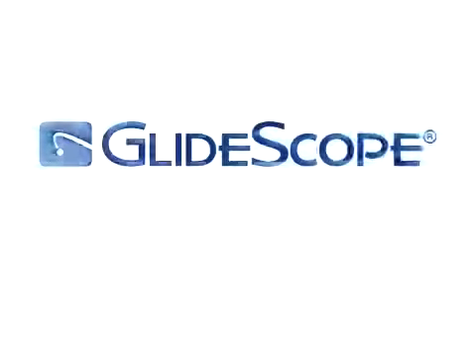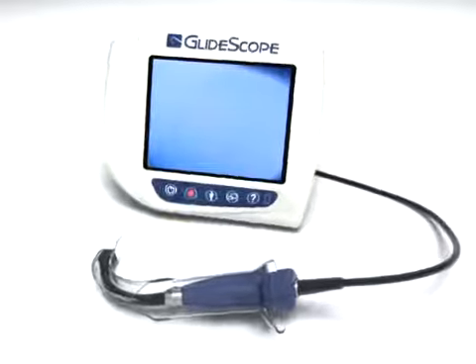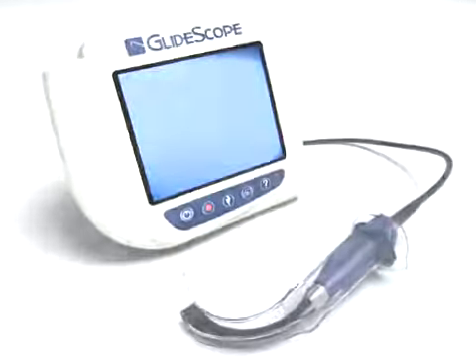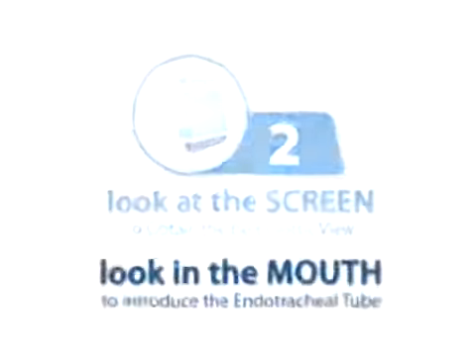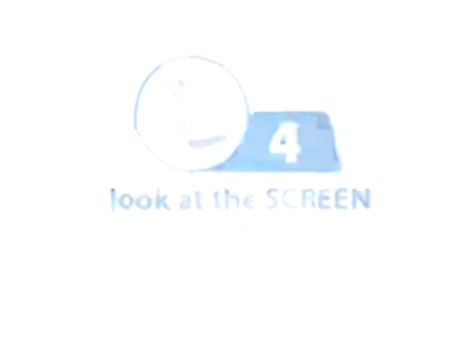The GlideScope video laryngoscope, designed for first-pass success. A four-step technique to GlideScope video laryngoscopy combines direct vision of the patient with views on the GlideScope video monitor. Start by looking in the mouth to introduce the laryngoscope, at the screen to obtain the best glottic view, back in the mouth to introduce the endotracheal tube, and finally, at the screen to intubate.